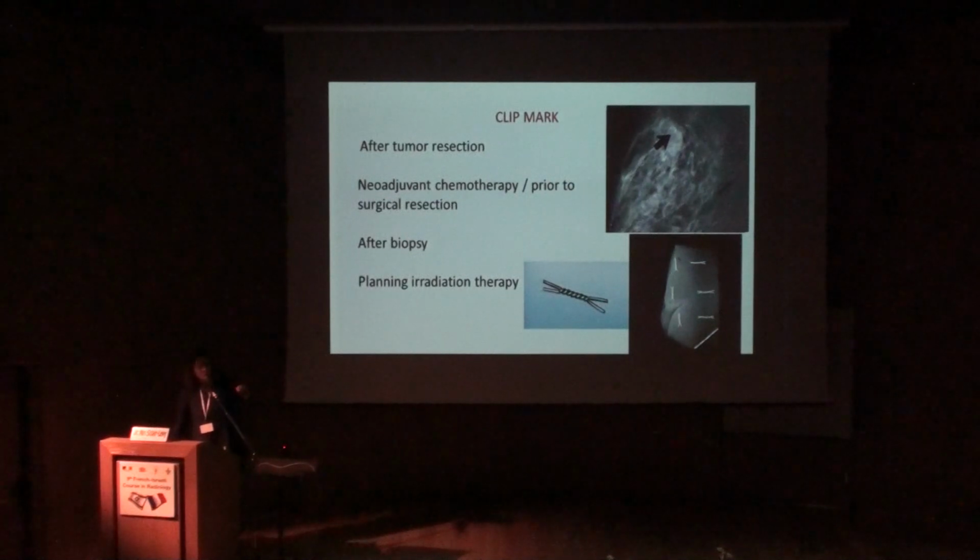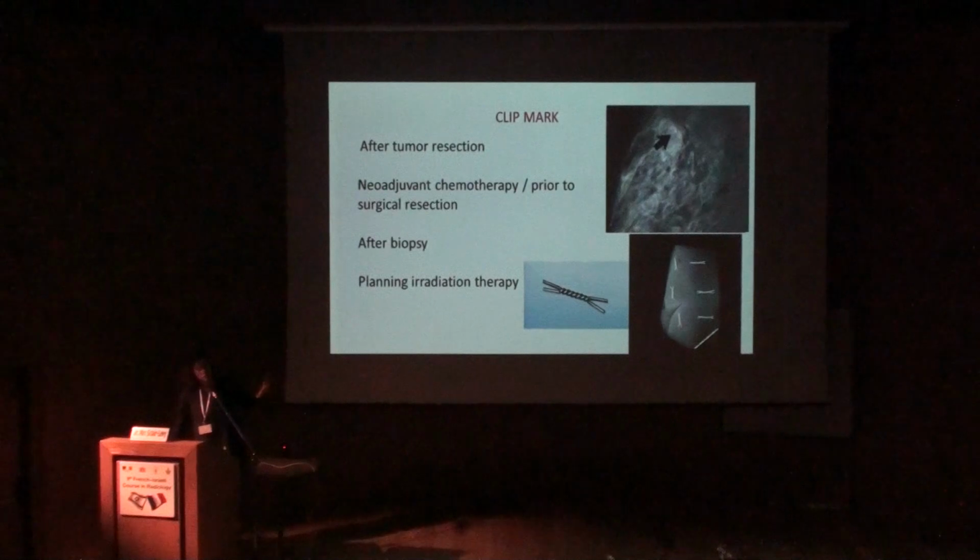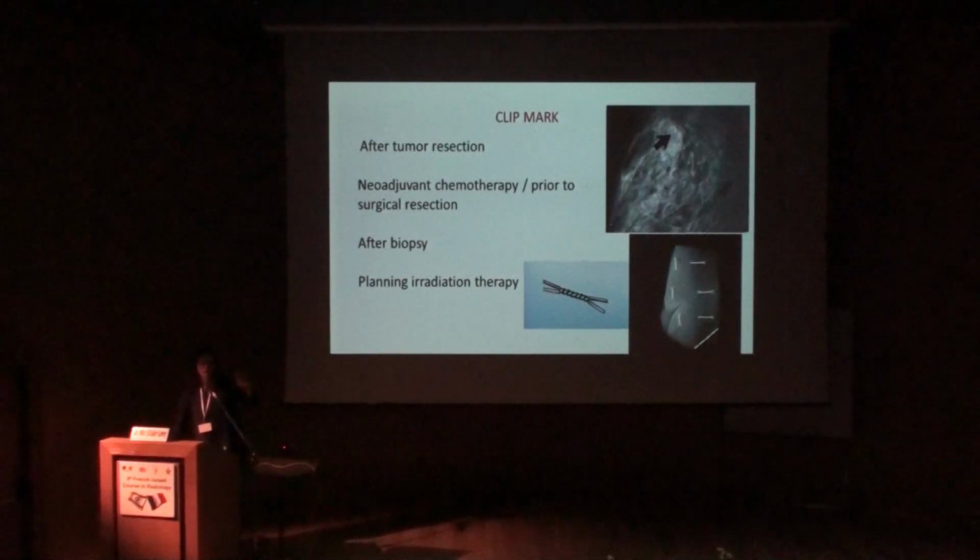In addition, we sometimes do a biopsy for very small lesions that might disappear after the biopsy. It is important to leave a clip mark in case it turns out to be breast cancer, so that we will know where the lesion was. Most clip marks are MRI compatible, they are not moving, the woman doesn't feel them, but they are very important for the planning of the treatment or for the follow-up of the patients.